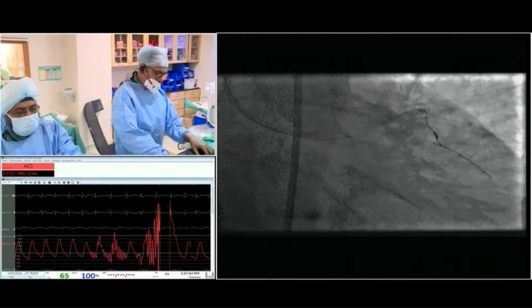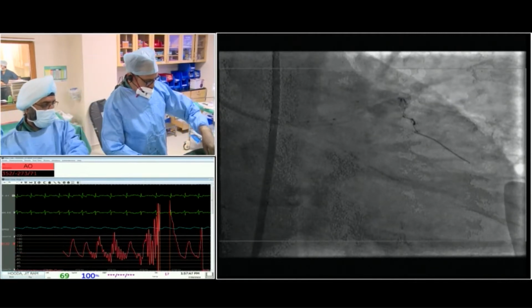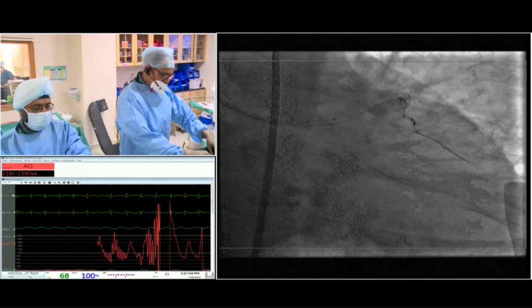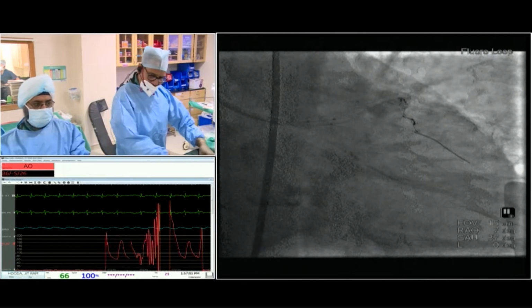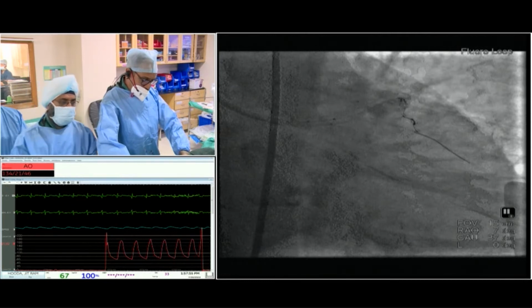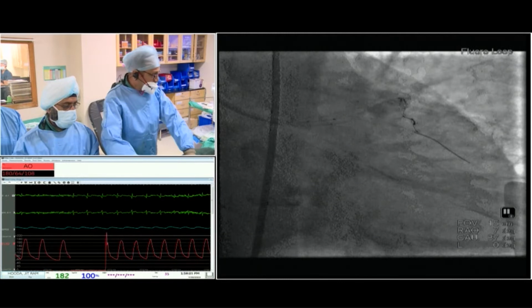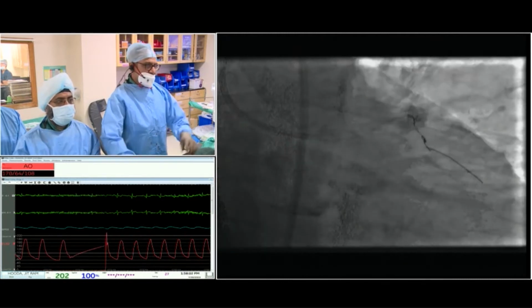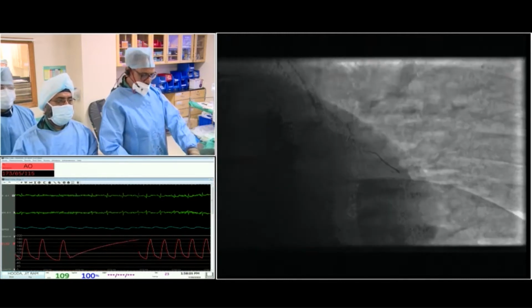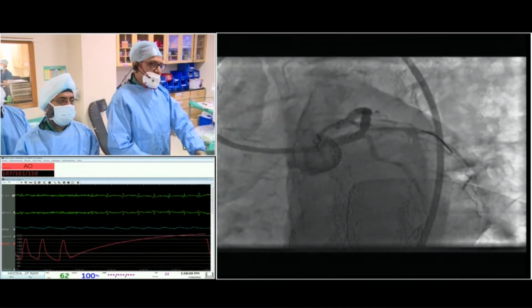Patient is doing fine. He tolerates these inflations well. And did you see the IVUS runs, Dr. Shri Kumar? Yeah, Srinivas? Before one where we have seen, now I think post left main stent you will do IVUS run. Before and after rota, yeah. Okay. So go to spider. So I take a check shoot here and then recross into the ramus, which fortunately for me is flowing nicely.